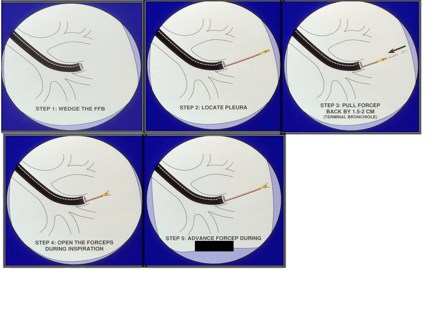Let's talk about the technique for random transbronchial biopsies. The first step is to wedge the flexible bronchoscope in the bronchus of your choice. You will then advance the forceps under fluoroscopic guidance to locate the pleura. Next, pull back on the forceps about 2 centimeters to the level of the terminal bronchiole. Open the forceps and then advance the open forceps slightly before instructing your assistant to close. Pull back on the closed forceps gently while keeping the bronchoscope wedged and retract them completely from the working channel to obtain your biopsy sample. By advancing the bronchoscope as the forceps are withdrawn, the scope is maintained in the wedged position. There is no need to pull the forceps quickly or forcefully up into the bronchoscope.